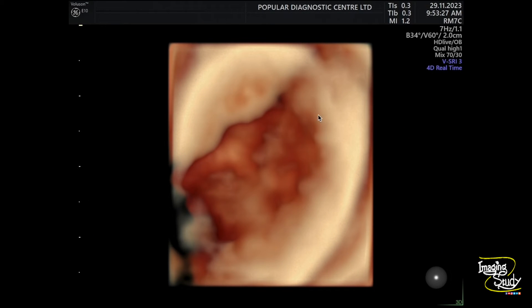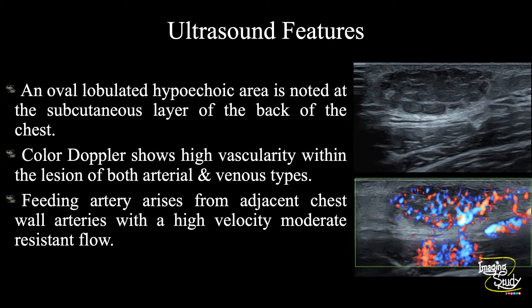Here is the 3D image of the lesion taken with a volumetric convex probe. In summary: an oval lobulated hypoechoic area is noted at the subcutaneous layer of the back of the chest. Color Doppler shows high vascularity of both arterial and venous types. The feeding artery arises from adjacent chest wall arteries with high velocity moderate resistant flow. These features are consistent with a case of superficial hemangioma.